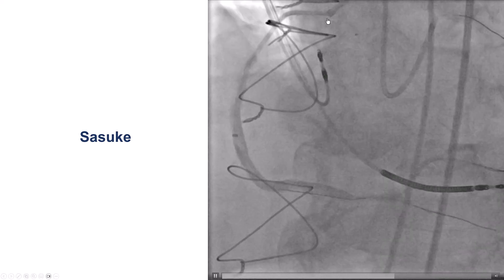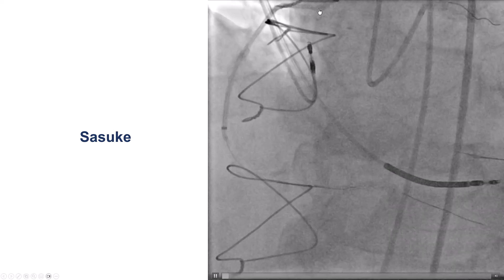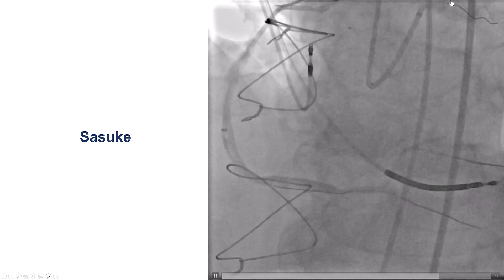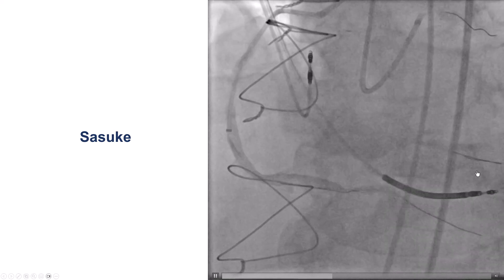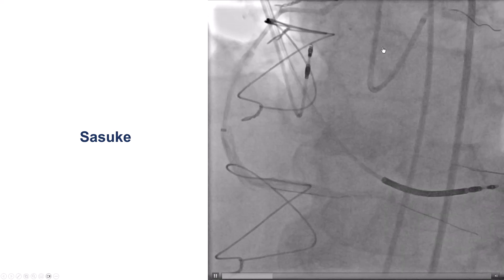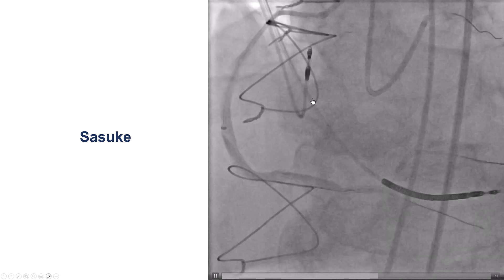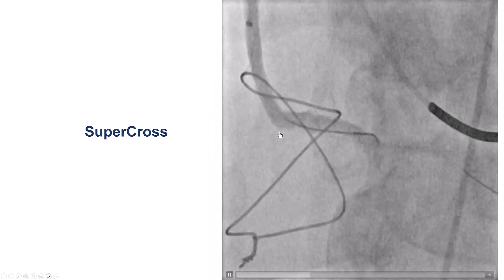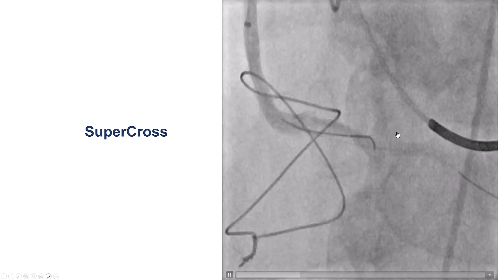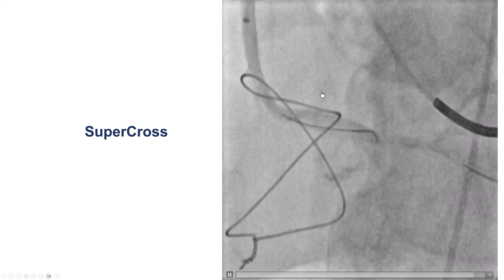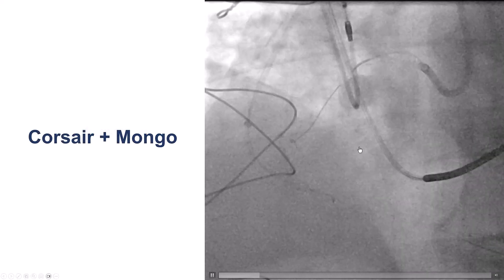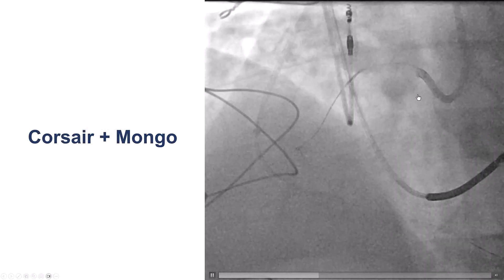This is also an example of the sequential dual-guide technique: one guide going into the vein graft, another into the left main to visualize the right. With wires in place, we removed the left main guide and used the same access point to engage the native right coronary artery. We used a Supercross microcatheter to go retrograde through the saphenous vein graft, but were unable to advance a retrograde guide wire. After these failures, we decided to go antegrade.